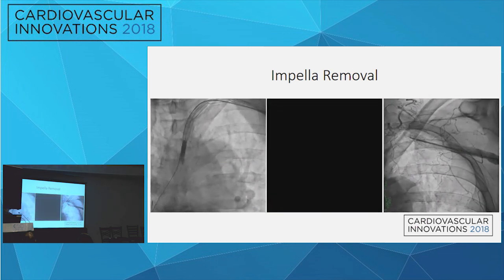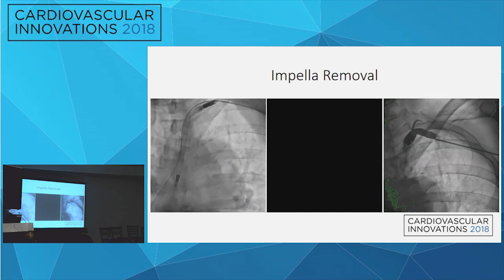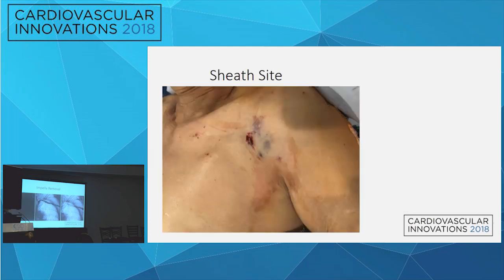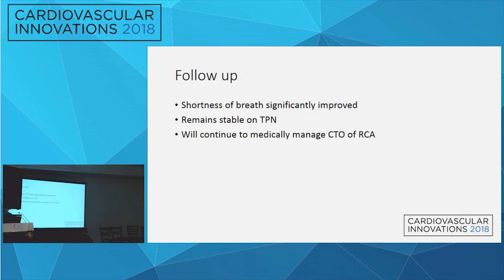You said you pre-closed? Yeah. Just one? Two. Two. Yeah. Kind of make that decision based on how big this was, a big artery. And this is what our sheath removal site looked like.